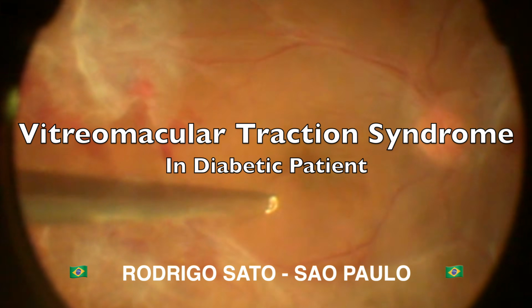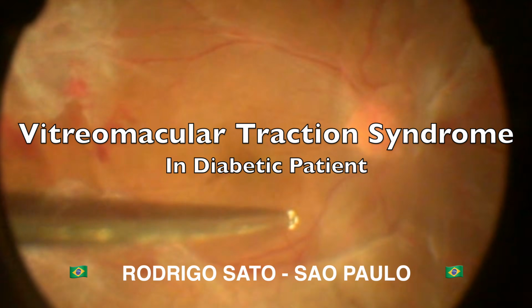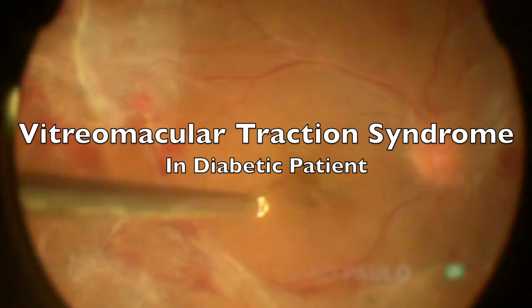In this video, shared by Dr. Rodrigo Sato from São Paulo, Brazil, we will discuss the surgical management of a case of vitreomacular traction syndrome in a diabetic patient.